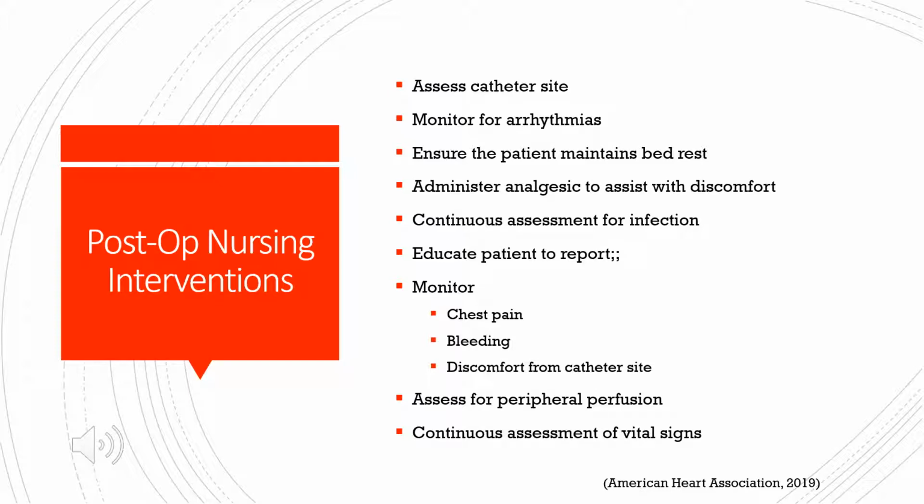The patient must maintain bed rest for anywhere from 2 to 8 hours, depending on their procedure. If the leg site was utilized, the leg must be kept straight and the head of the bed can be elevated up to 30 degrees. The nurse must assess peripheral pulses, capillary refill, and neurovascular status of the patient.